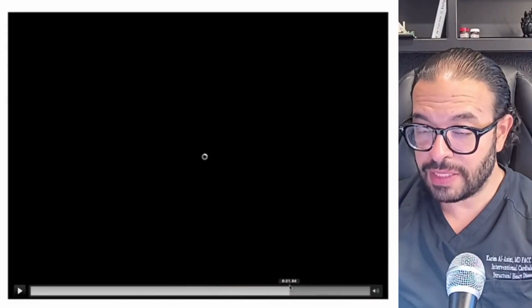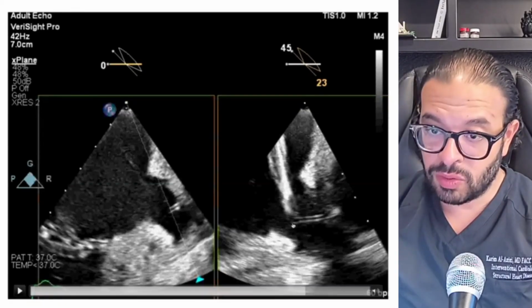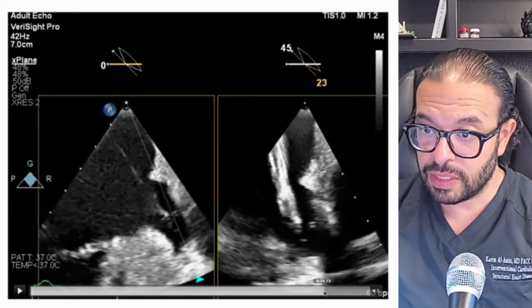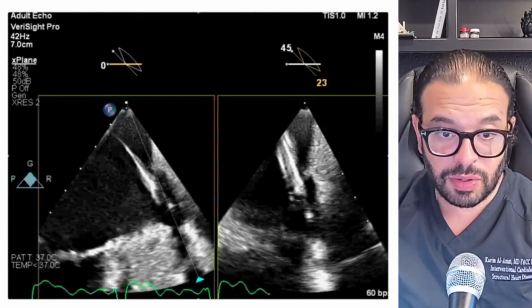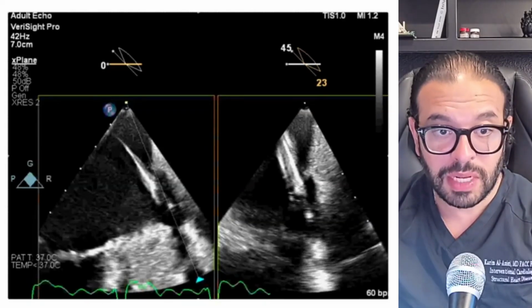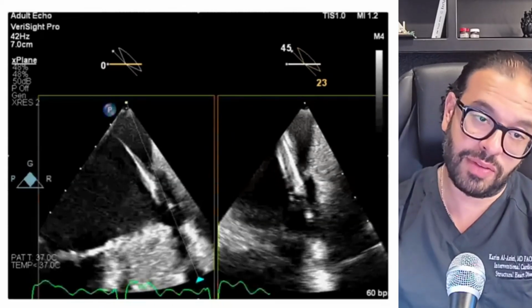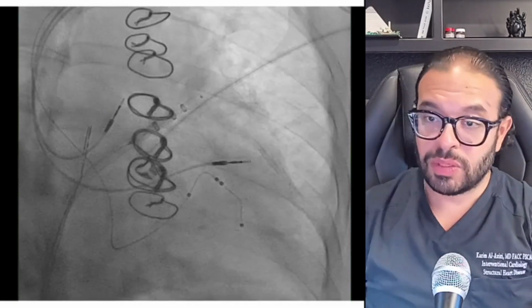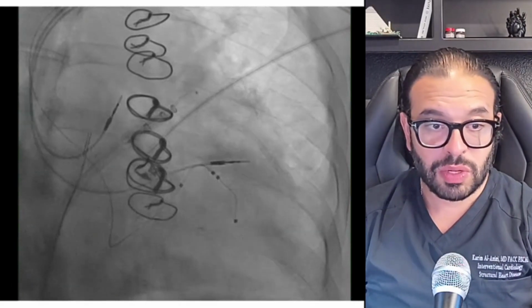As you can tell here from the ice catheter, we're getting the delivery system or the delivery sheath into the left atrial appendage. There's a pigtail catheter coming into play, and subsequently the device is slowly being brought up into the sheath. Here you can appreciate the catheter being filled with contrast, and an appendogram is being done in order to inject dye in that appendage in order to get a sense of the anatomy, but also the depth of the catheter from fluoroscopy.